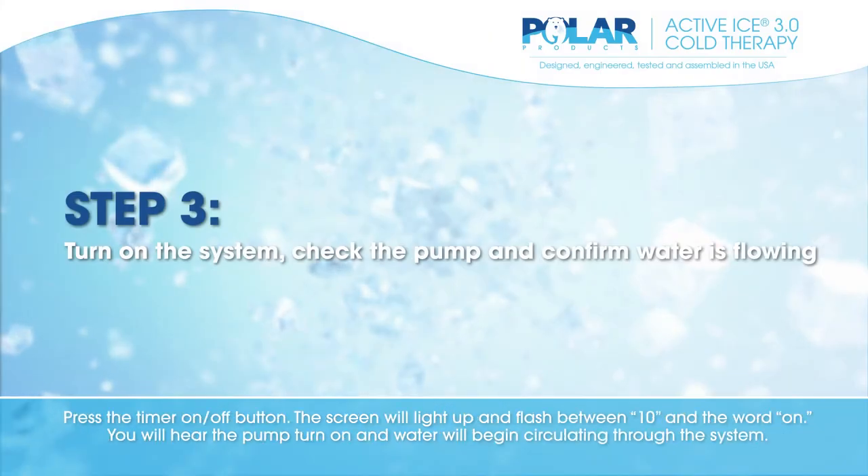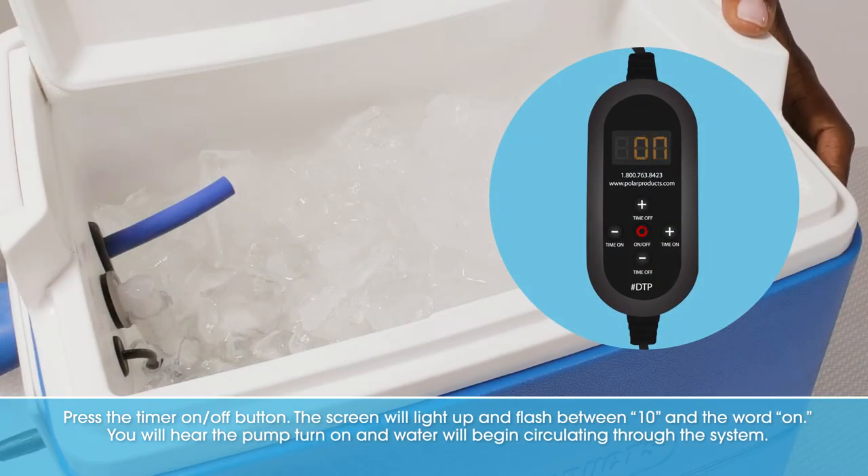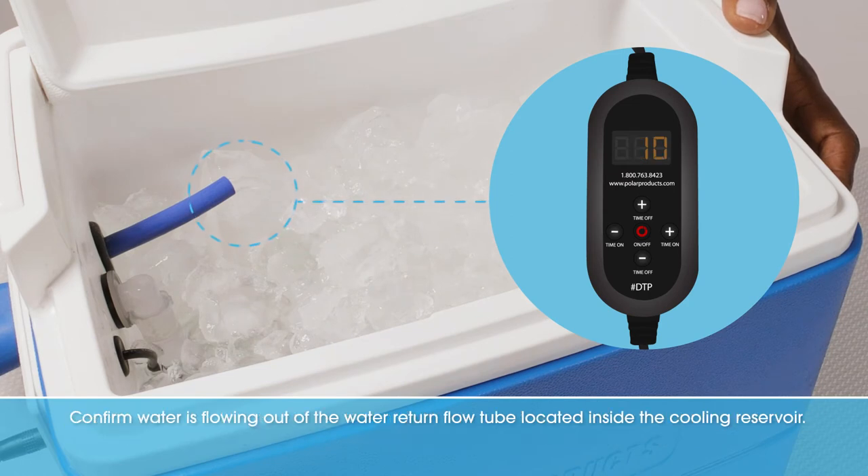Press the timer on-off button. The screen will light up and flash between 10 and the word on. You will hear the pump turn on and water will begin circulating through the system. Confirm water is flowing out of the water return flow tube located inside the cooling reservoir.